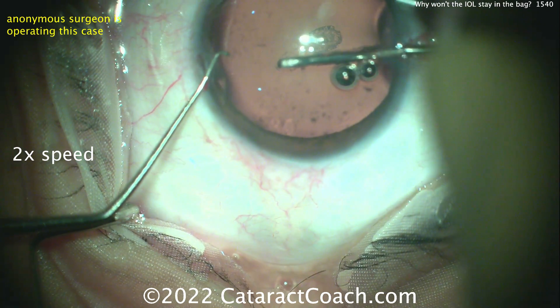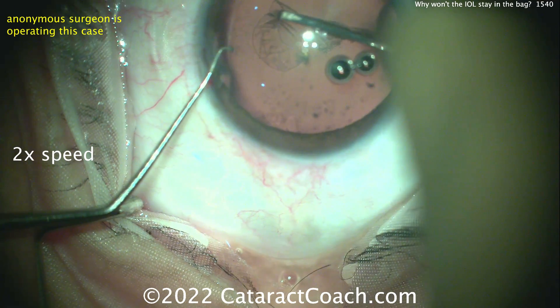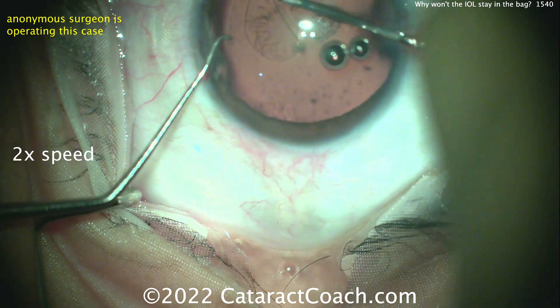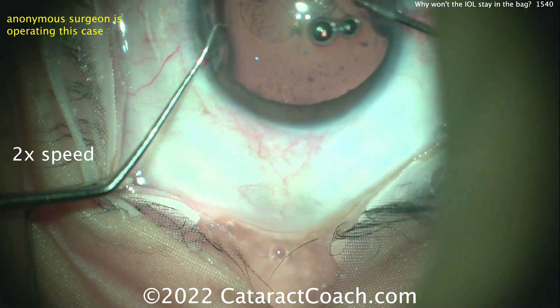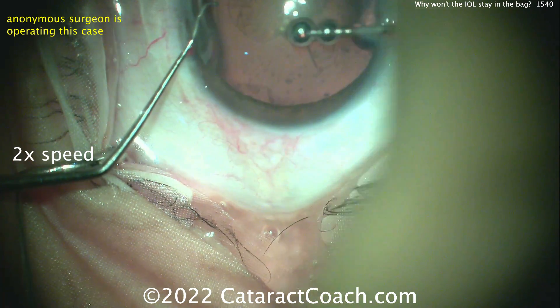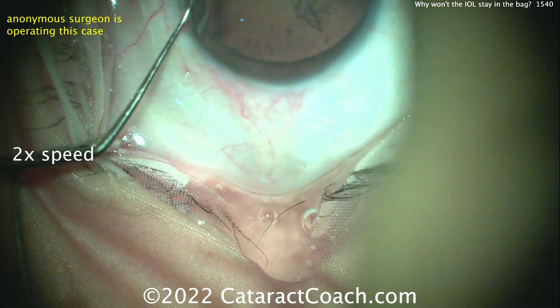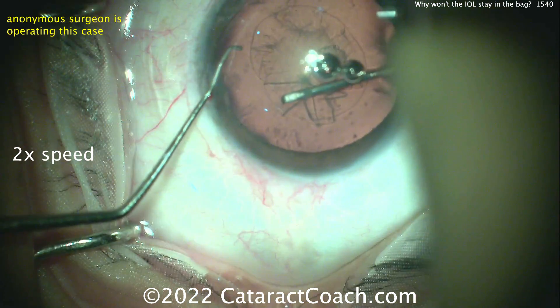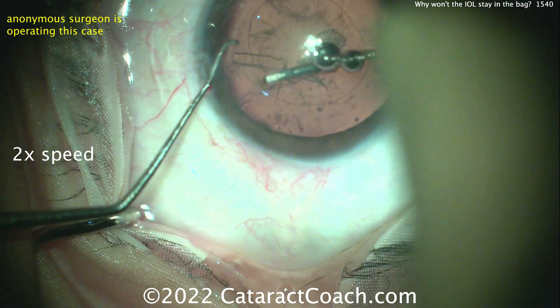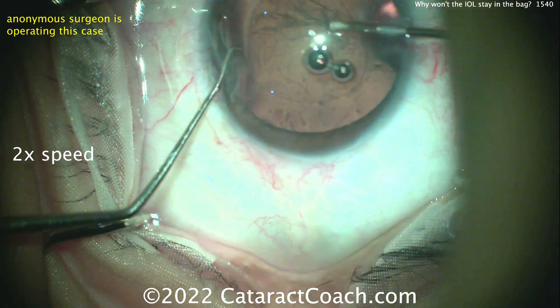Starting off with the capsulorhexis and holding the eye with the chopper through the paracentesis and using a cystotome here. A little bit off our screen here, so this may be more of a novice surgeon. Experienced surgeons will keep the eye in primary and centered for the whole case. Sometimes novice surgeons allow it to get off screen. It's a pretty good-looking rhexis — I'll take it.